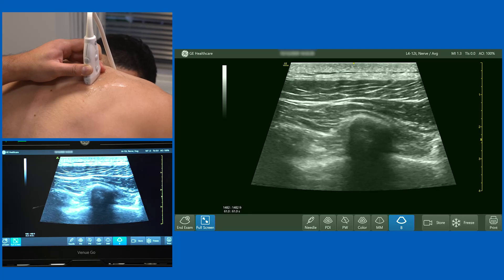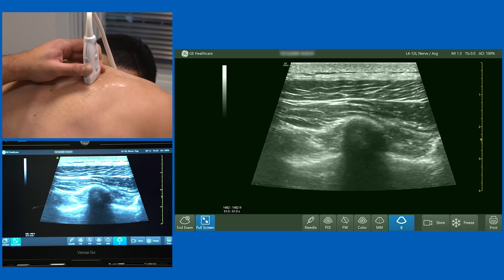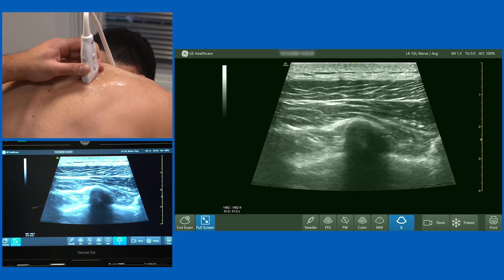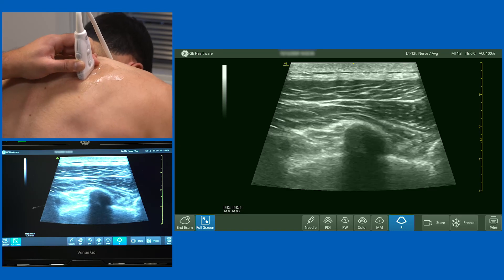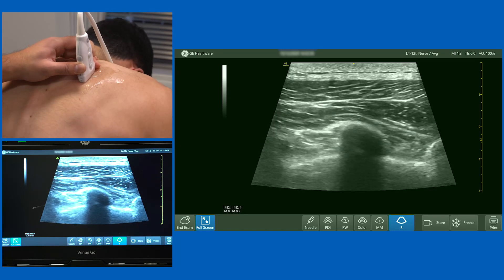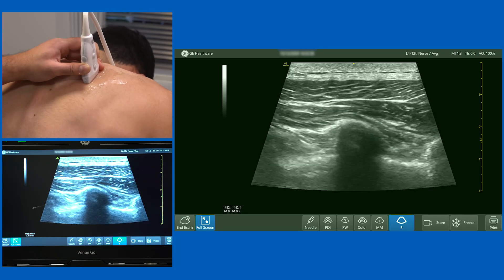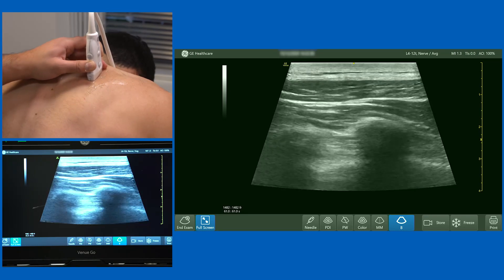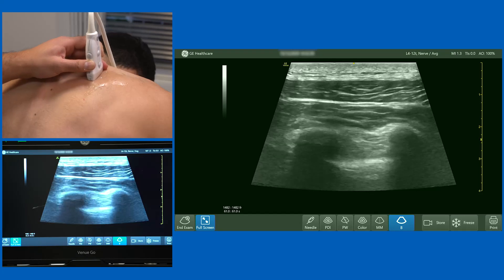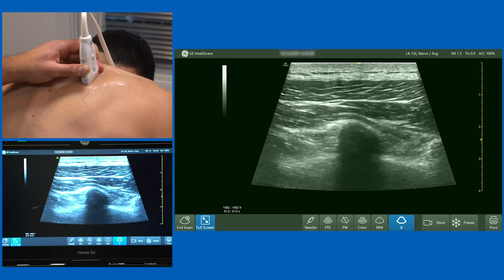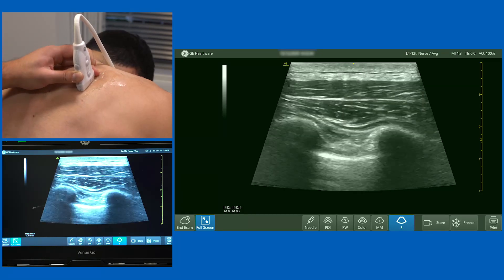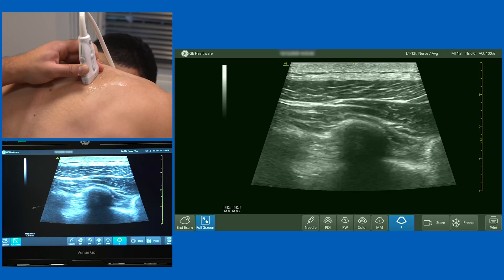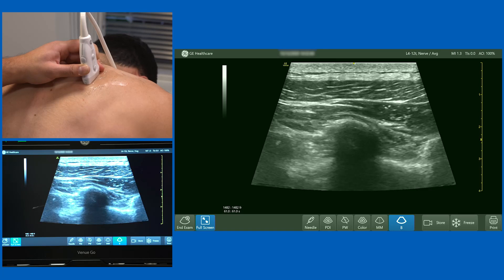If you look deep to the rib and ask the model to take a couple of deep breaths in and out, you'll see a glistening white line of the pleura. So we've got a rib here, another rib here, and a rib here — three ribs on the screen. I'm going to focus on the one in the centre.